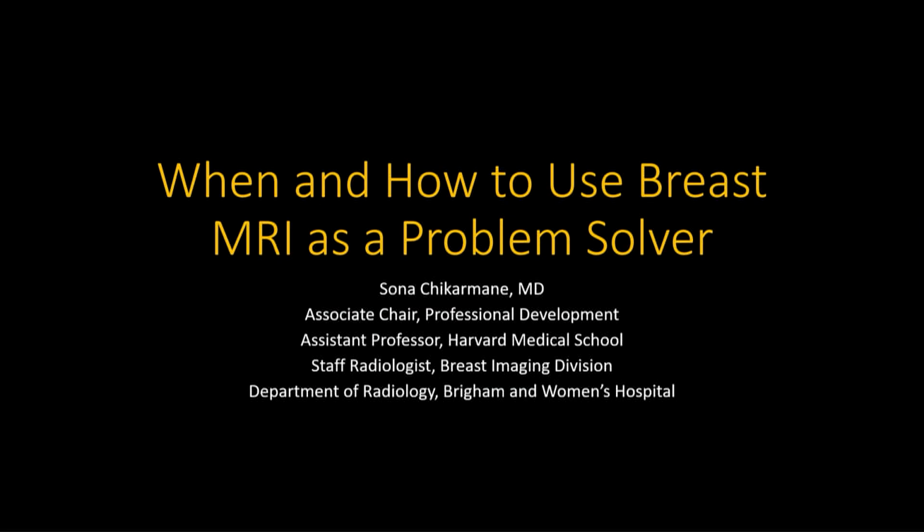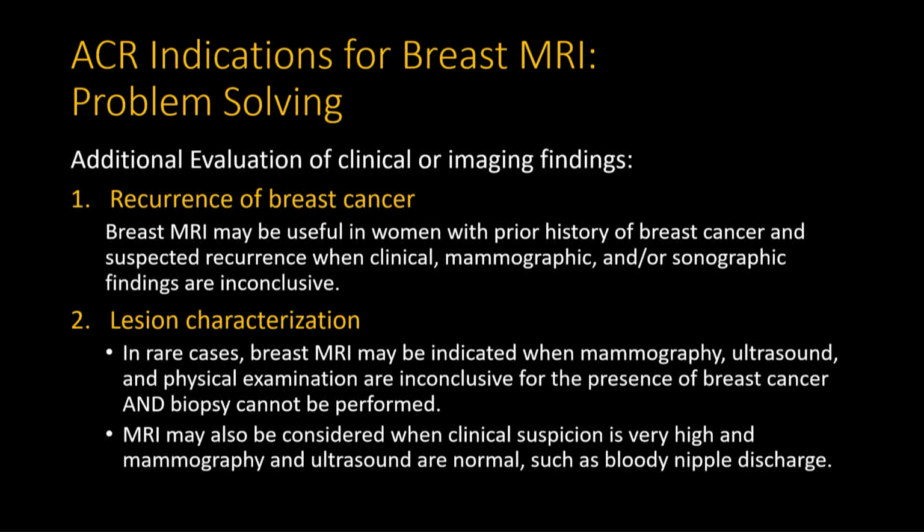I will now be talking about when and how to use breast MRI as a problem solver. As I mentioned before, we had some great talks about extent of disease and other diagnostic indications for breast MRI. So now I'm going to focus on just problem solving. The ACR says that there are two categories in which problem-solving MRI may be indicated.